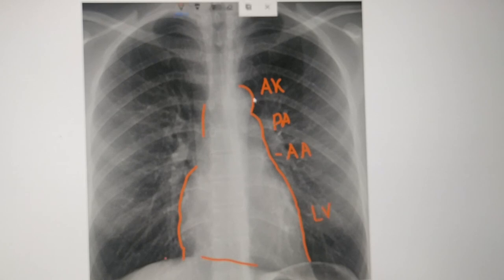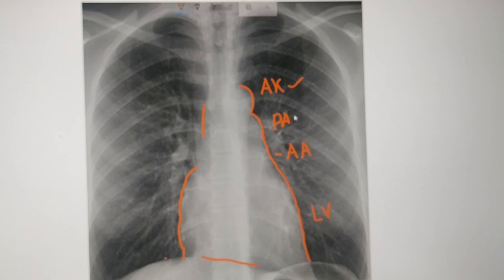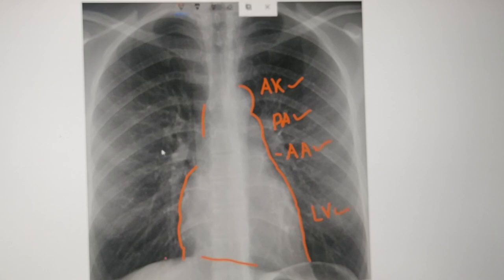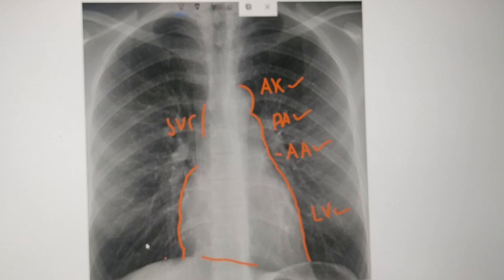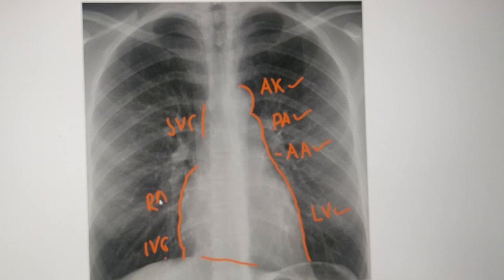So the left border of the heart is formed by four structures: aortic knuckle, pulmonary artery, left atrial appendage, and left ventricle. And the right border is formed by the superior vena cava, inferior vena cava, and right atrium. Thank you all.